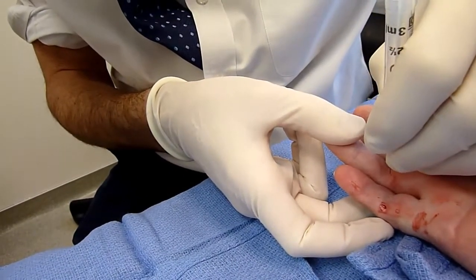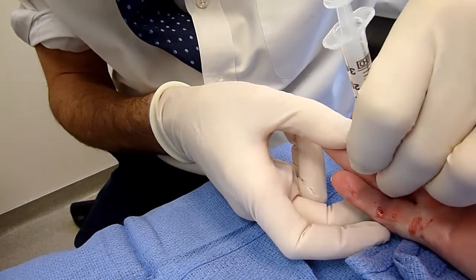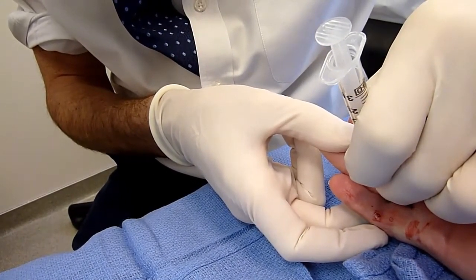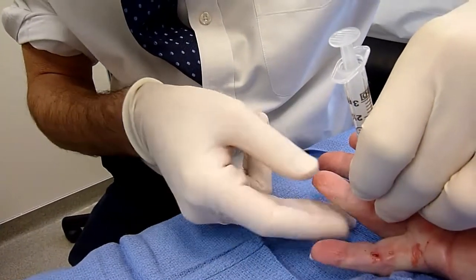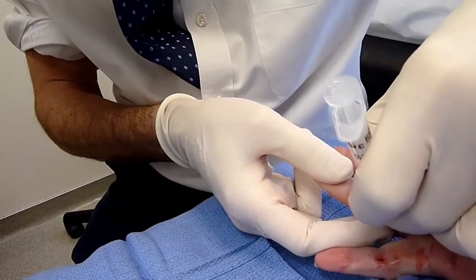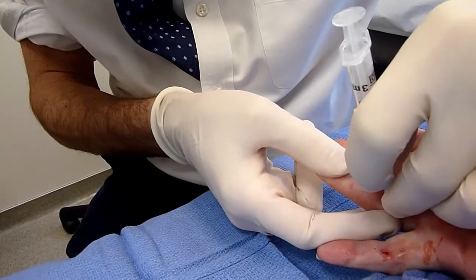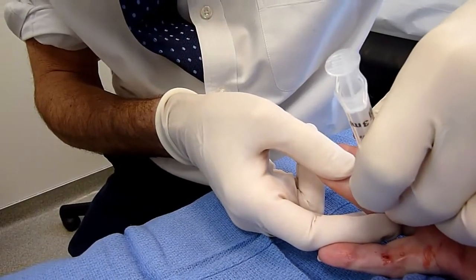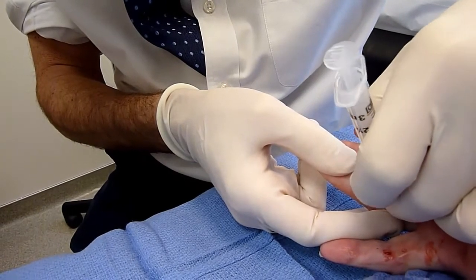You ready? Oh, yeah, I'm ready. Little needle poke here. Yeah. Ouch. Don't feel a thing. All right. Keep that small finger just a little bit away from me. There you go. So I can get my finger in there. Okay, perfect. So am I a good patient? Yeah. I don't feel a thing. Are you even touching the cord? Yeah, I'm just to it now.